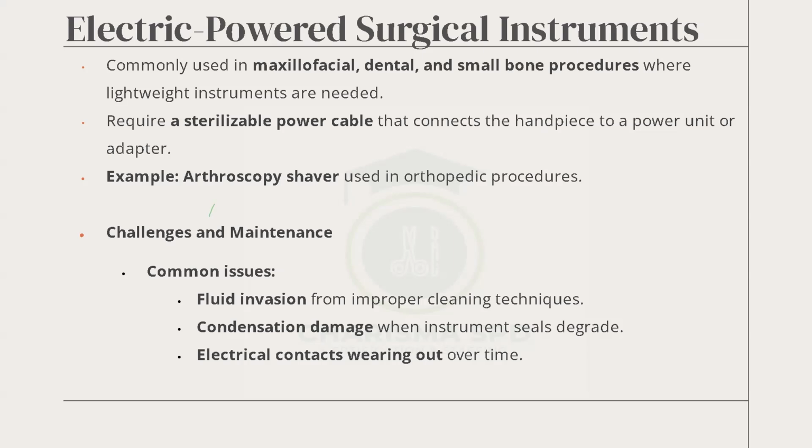An example is the arthroscopic shaver used in orthopedic procedures. We'll see the shaver, I'm sure, somewhere along the line. I can't describe it for you to see right now. It has a cable that is joined to the shaver, and that is connected to a machine called a console, right? That produces the energy for this to work. Arthroscopy shaver means that they use it to shave some bones or to shave certain parts.